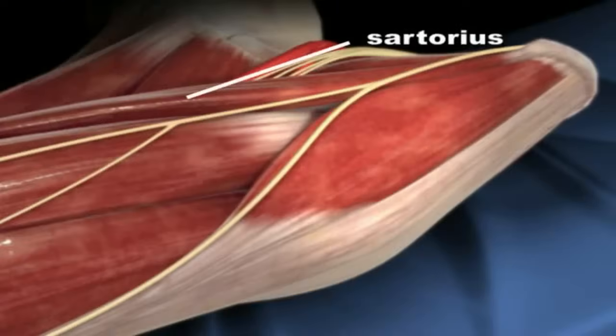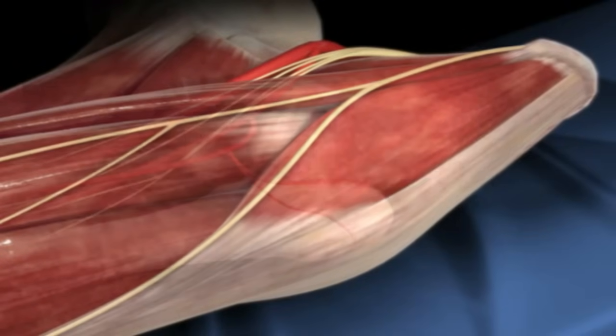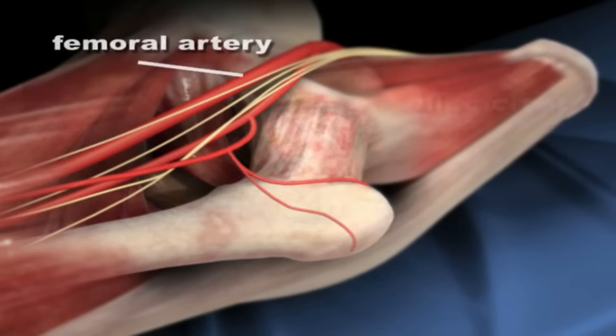The video is now pointing out different anatomical structures around the hip, including the femoral artery and nerve, which run towards the front of the hip joint.